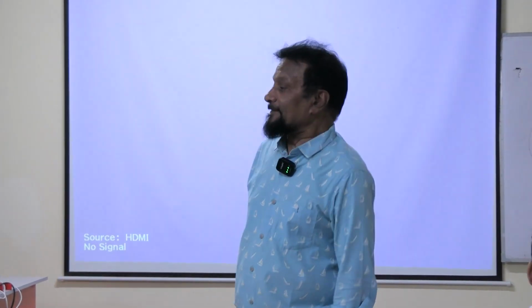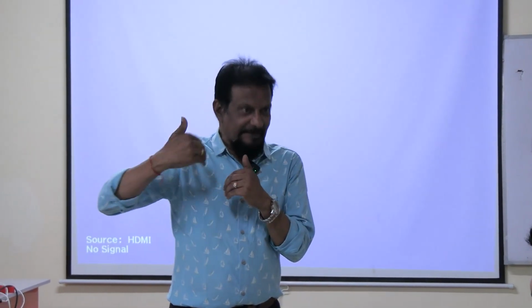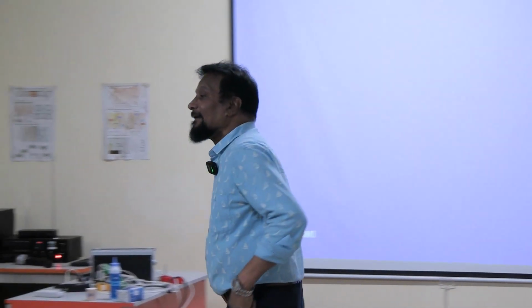Now, where to put the positive electrode in case of V1? It is on the right sternal border at the 4th intercostal space. You know the 4th intercostal space? It is the space originating from a particular area of the border. So right sternal border, 4th intercostal space. You have to place the electrode there, and if you take the recording, you will get V1.